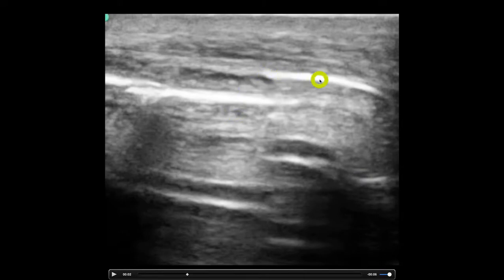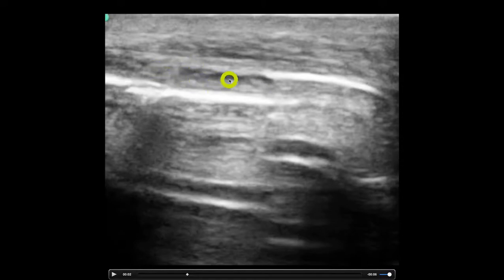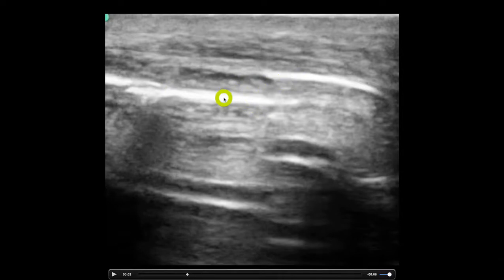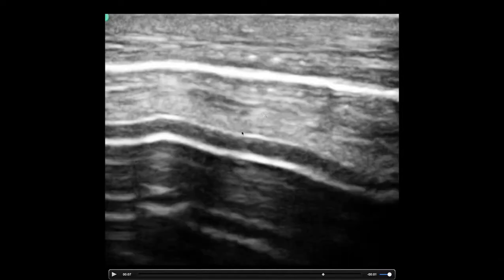Now contrast that — which is free air — to this down here: we can actually see a normal peritoneal stripe and actually this up here is the bowel wall and we're seeing some air within the bowel lumen. This is free air; this is air that is not free — it's inside the lumen.